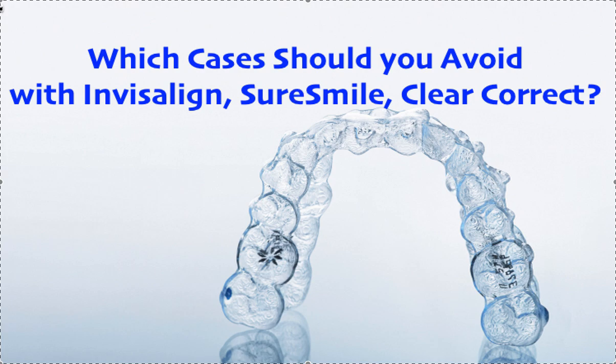Number 1, anterior open bite cases. Don't do it. Just don't. Any anterior open bite, little one, big one, it's a no, okay? I feel like it's a no.